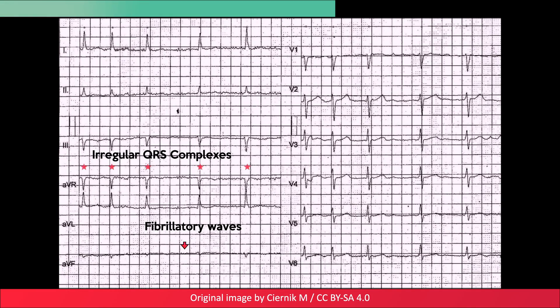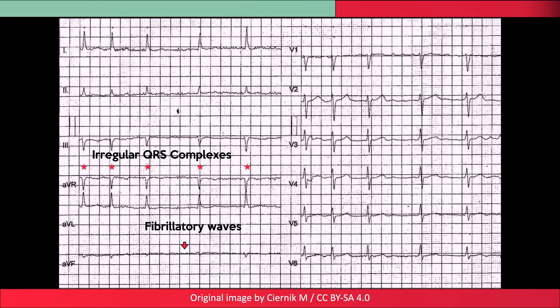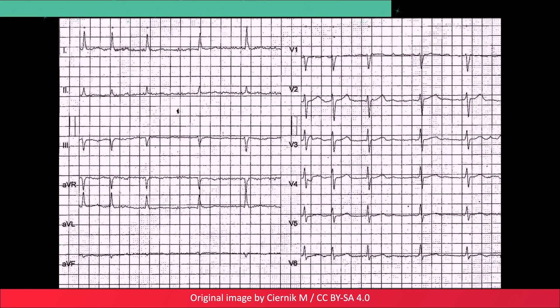Since the RR intervals are irregular, the ventricular rate cannot be calculated in the classical sense. Instead, you have to count the number of QRS complexes within a 6-second interval and then multiply by 10.